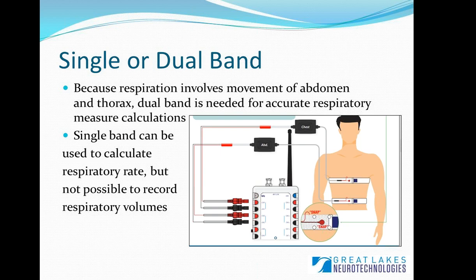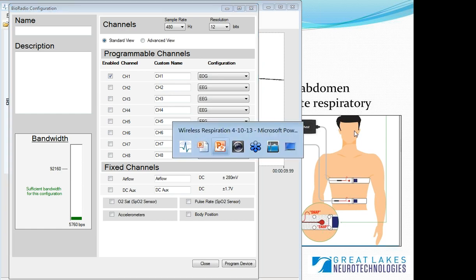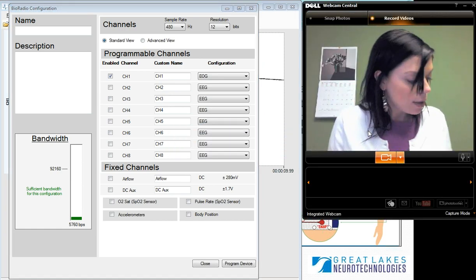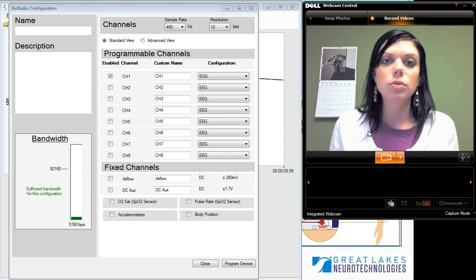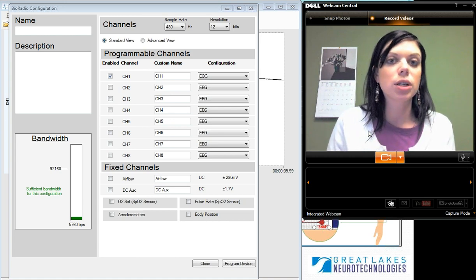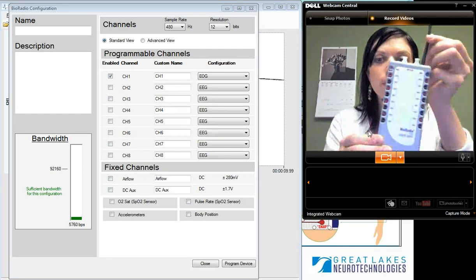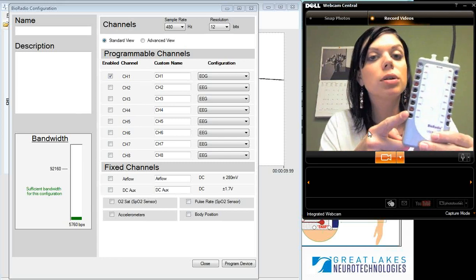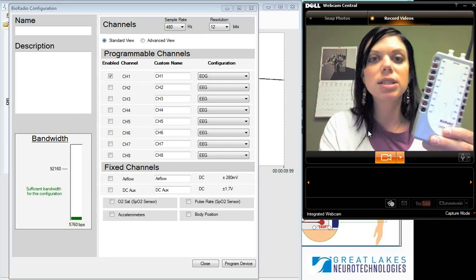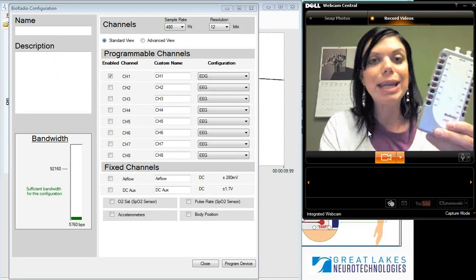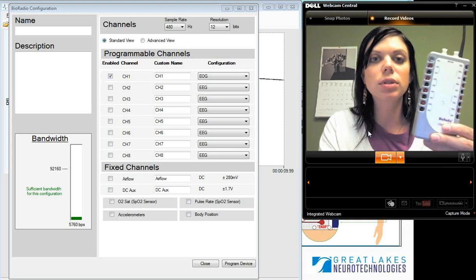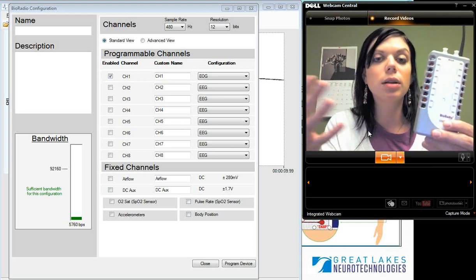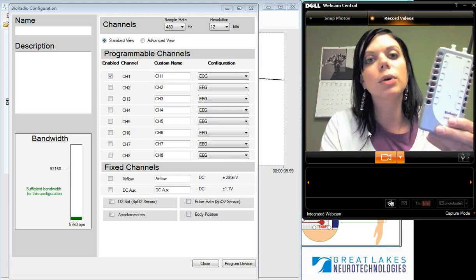I'm going to give you a demonstration of wireless respiratory measurement using RIP, switching over to our data acquisition software. This is our BioRadio data acquisition device — a wireless eight-channel physiological monitor — which I'll be using to record the respiration data. There are inputs along the front on which you can measure really any type of physiological signal. For today we'll be demonstrating RIP, but you can also record ECG, EMG, blood oxygen saturation, and several other parameters. It's a nice flexible device for a number of different applications.